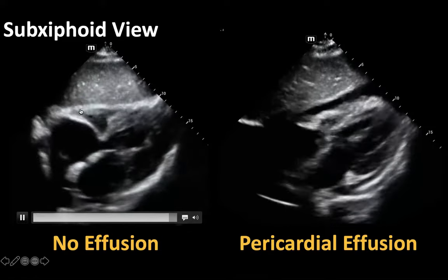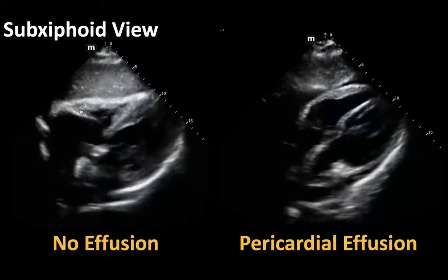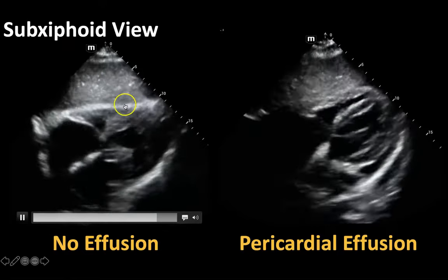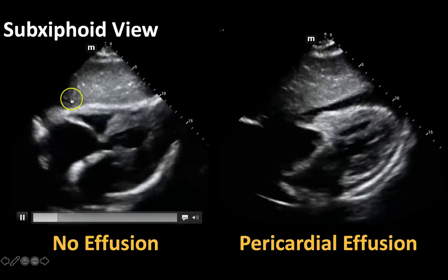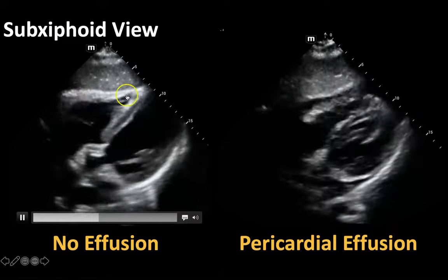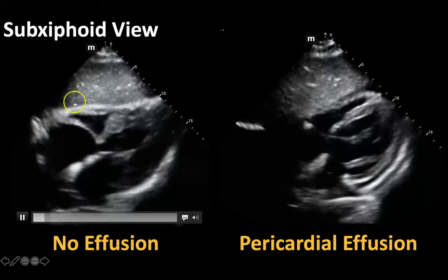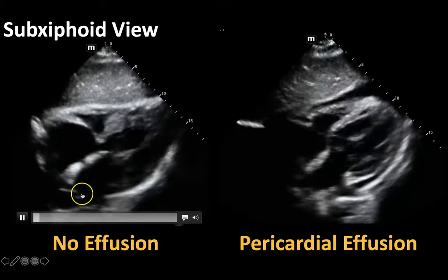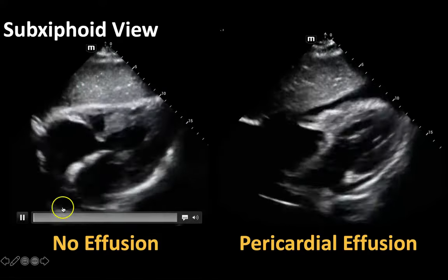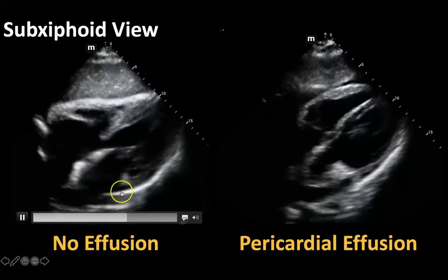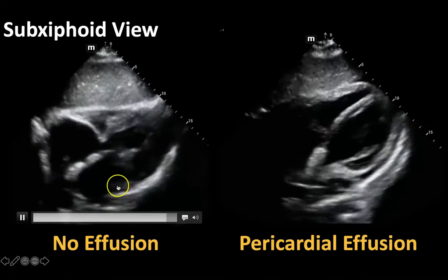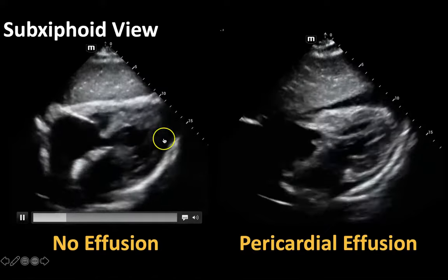What we're really focusing on in this particular view when we're looking for effusion is just the outside of the heart. Between the liver and the heart, this is where we'd expect to see that black sliver if there were any pericardial effusion. Then we focus our eye posteriorly to see if there's any circumferential effusion. We look all the way around the heart and we don't see any black stripes, so we say there's no pericardial effusion on this heart on the left side of the screen.